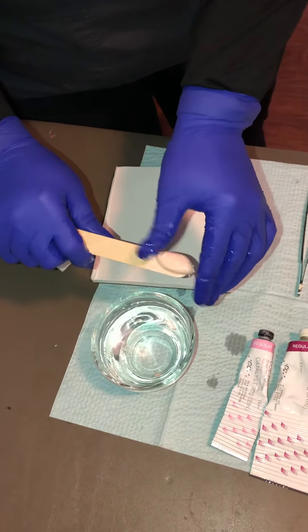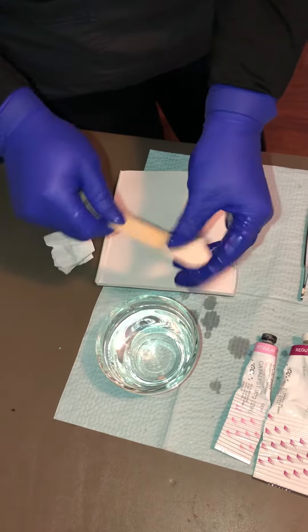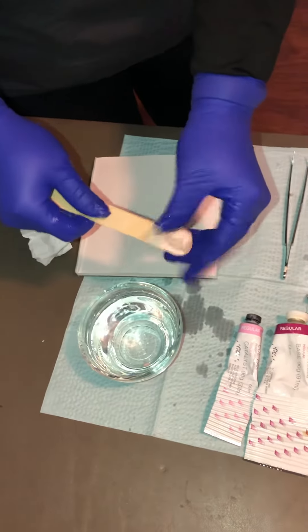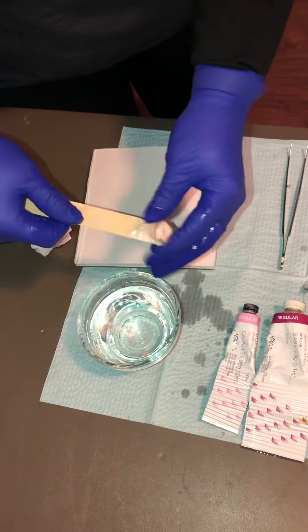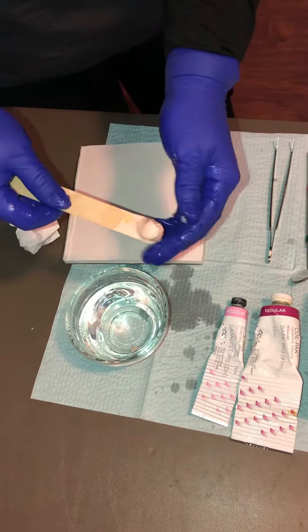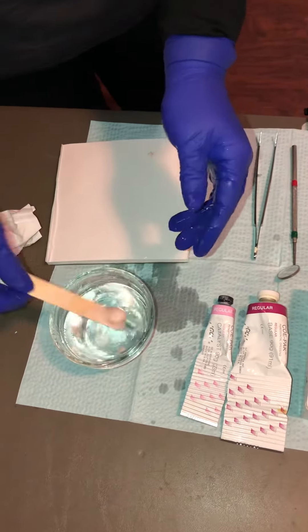Just check it — a little bit longer. The periodontal dressing acts as a band-aid over the surgical site. It just protects it from temperatures, different types of food, and daily activities like talking and brushing — all of those things.